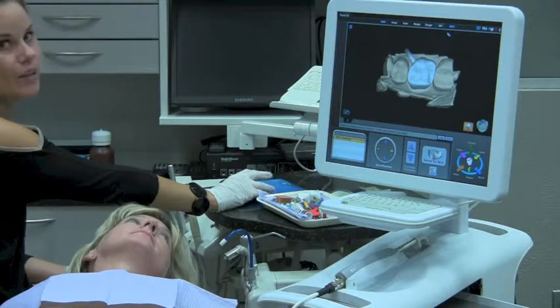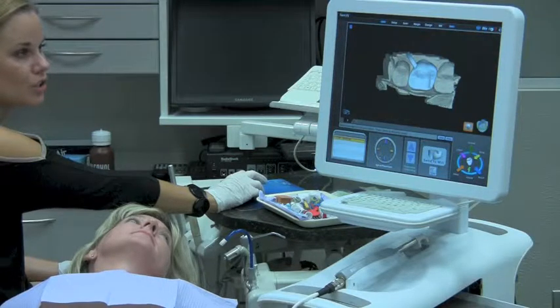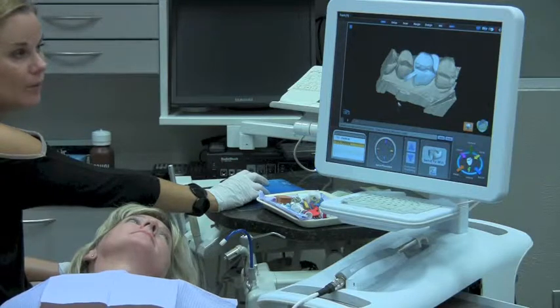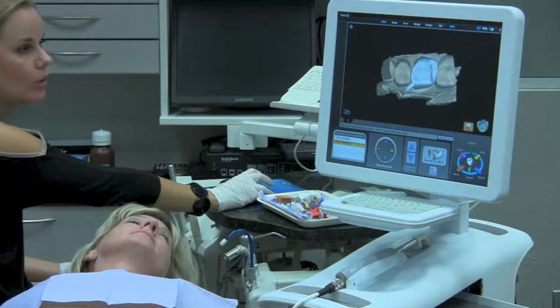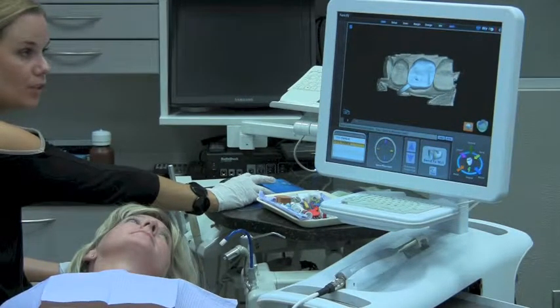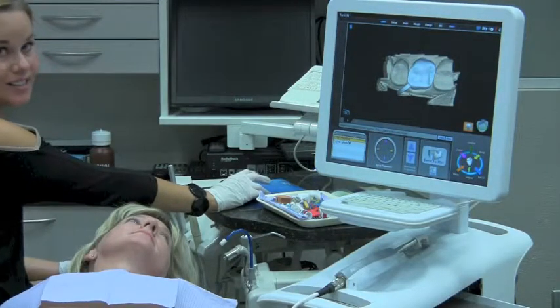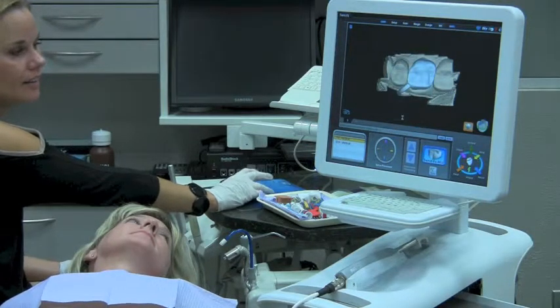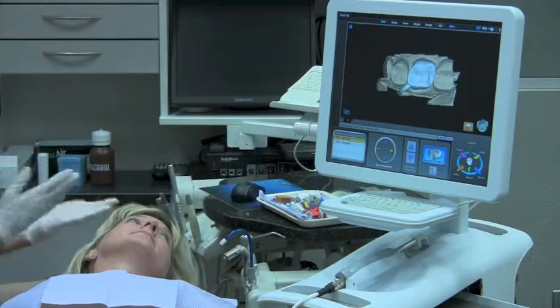We made the tooth look good, and then we ensured that it's going to function well. I have the ability to move the sprue if I need to — as long as it's away from the margin and out of the contact, I'm pretty happy with the location. I don't really worry buccal or lingual, just away from the margin and out of the contact. We choose our block size: the restoration will fit on a 12 or a 14. I have a 12 in stock so I'm going to send that on a size 12 — it's going to mill faster. With one click of the send to mill icon, I click OK, and I'm going to see that my restoration is being sent to the mill. That's how easy it is.